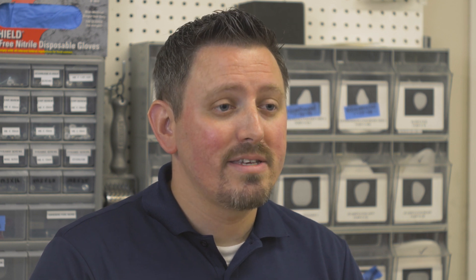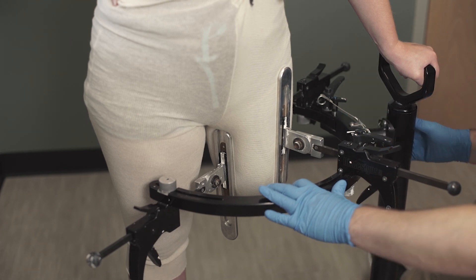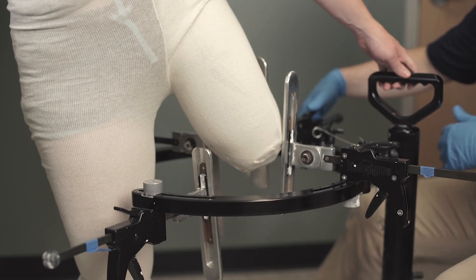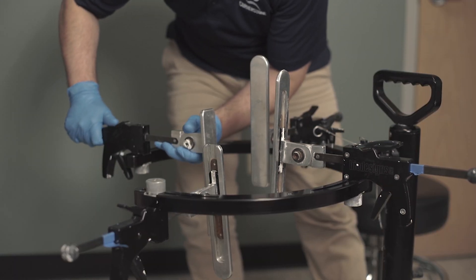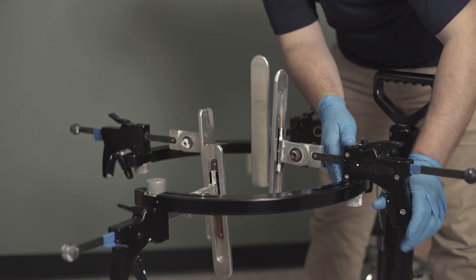When we're casting the patient, we put their leg in the stand and align the paddles to the desired compression release zones. After aligning the paddles on the patient, we take the patient out of the stand and recheck the paddle position to make sure that they're equal distance apart. This is very important to ensure there is equal level of pressure around the limb.